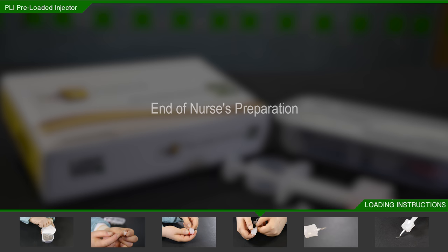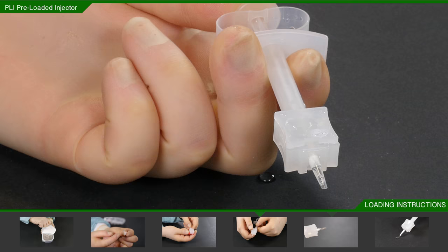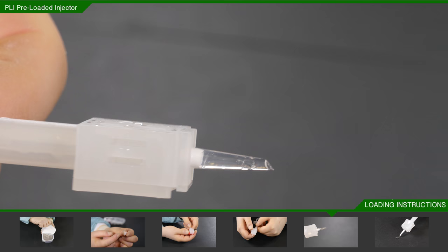Surgeon: Before entering the incision but under the microscope, depress the plunger until the lens and white cushion come into view in the tip. Rotate the injector 360 degrees to confirm that no part of the trailing haptic is trapped under the cushion.